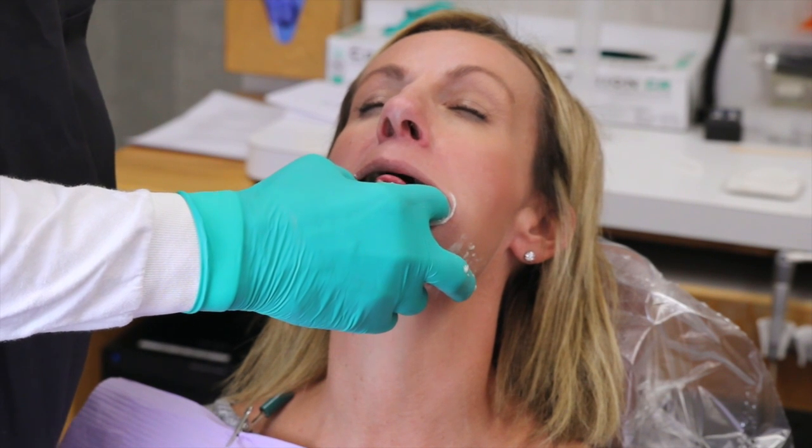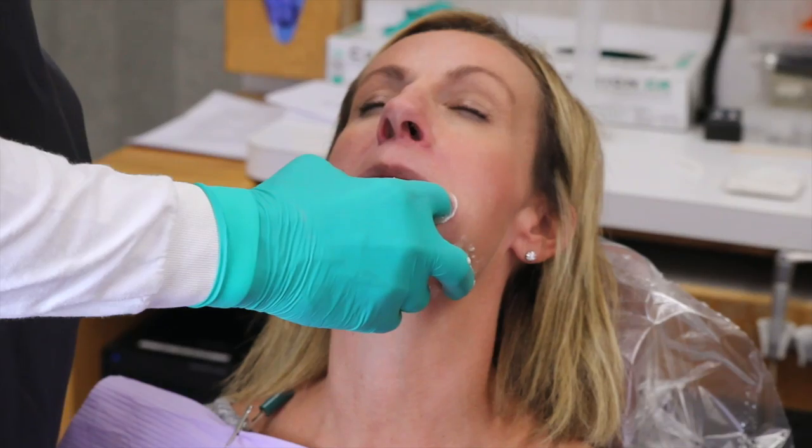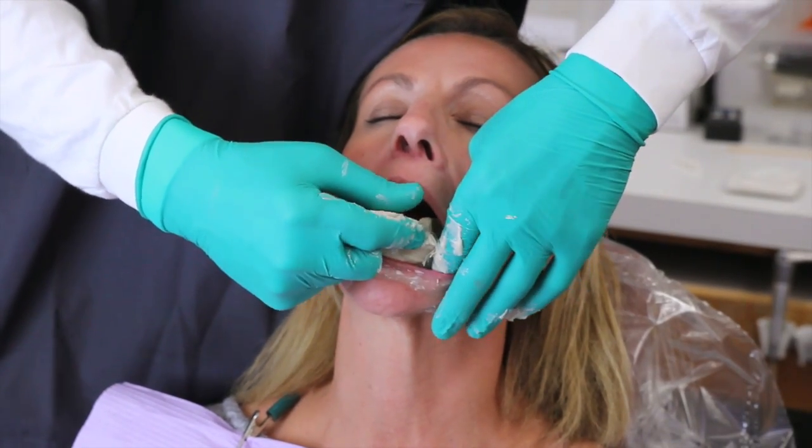Stick your tongue way out again. Way out. Great. Wiggle it again. Good. That should be good. Okay. And once again, try to remove the tray with a quick snap.